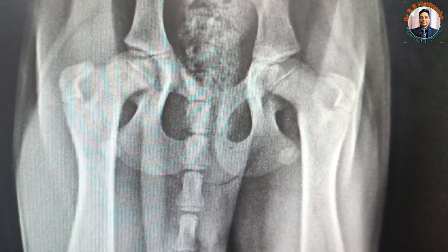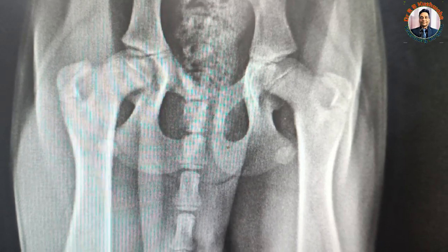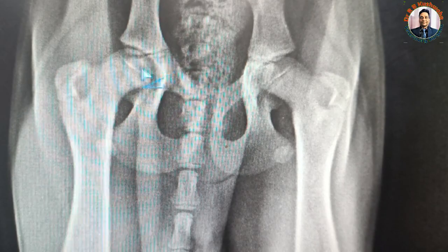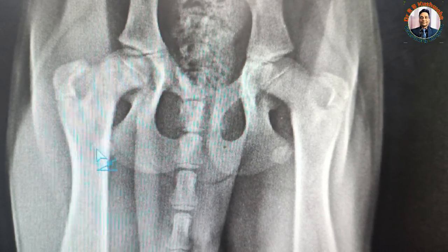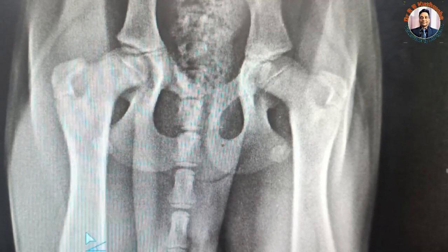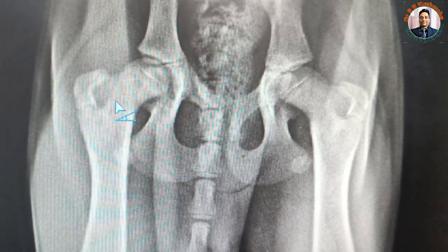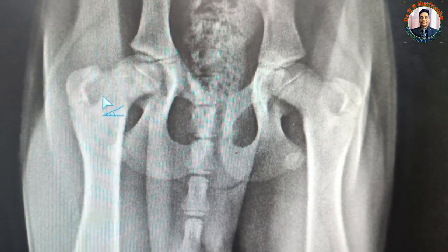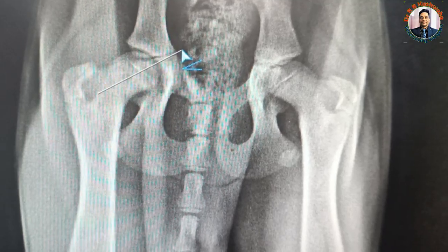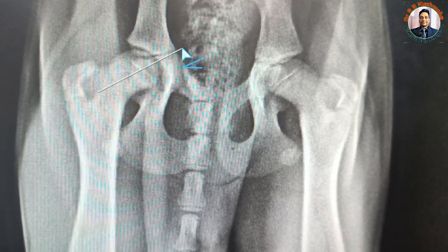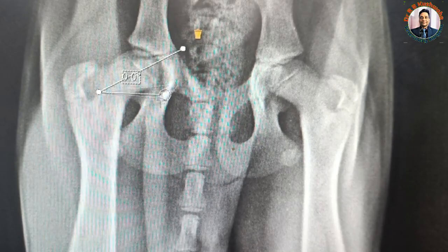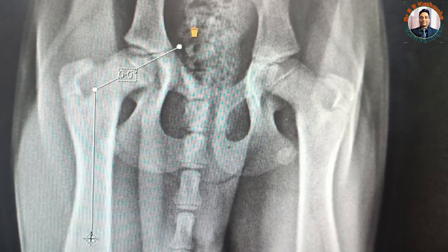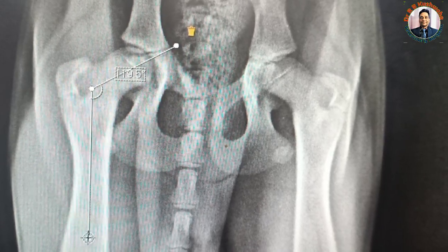For the measurement of this femoral head neck shaft angle, first we draw a line bisecting the femur head and neck, and then draw a line bisecting the shaft of the femur. You can see the center of the bisection of both. I draw first here like this, bisecting the femur head and neck, and then I draw a vertical line bisecting the shaft.